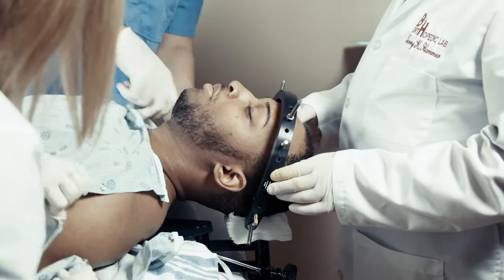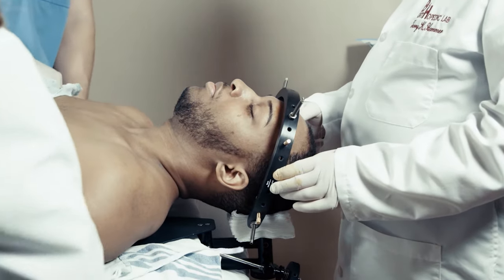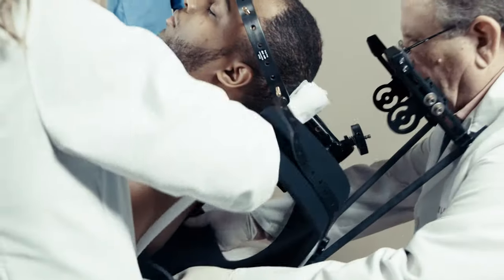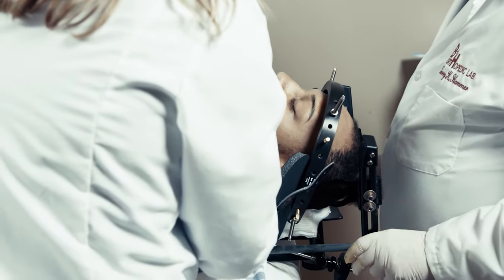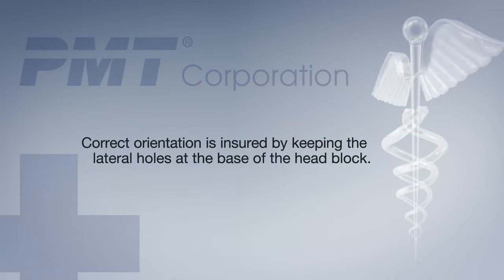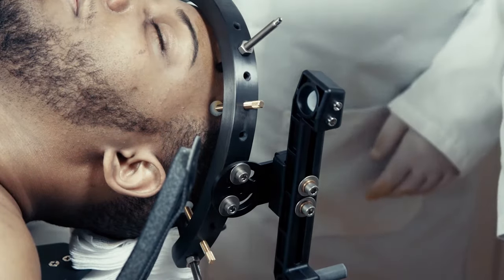Remove the outrigger. To place the posterior shell of the vest, unsnap the patient's gown and pull it down to the waist. Next, keep the patient's hips planted, then raise the patient's torso about 6 inches off the bed. Remove the positioning board and slide the posterior shell in place, then gently lower the patient. Correct orientation is ensured by keeping the lateral holes at the base of the head block. When properly attached, the head block should form a T above the patient's head.